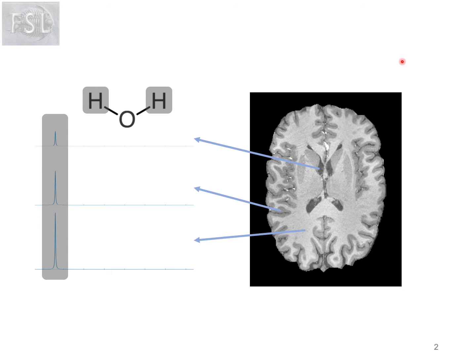The signal arises, and the image is constructed from, the signal of 2 equivalent protons, or hydrogen atoms, on the water molecule. In spectroscopic terms, the signal from each of these protons occurs at the same frequency, and if we were to form a frequency spectrum, we'd see just one peak. This single frequency, at a known frequency, can be thought of as a metabolic fingerprint of water.